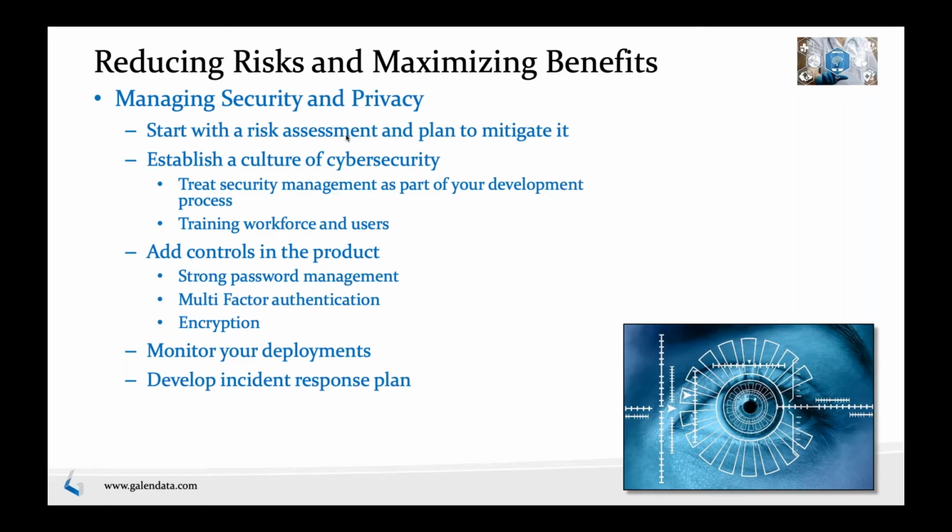Things like identifying who's responsible for what aspect of the response when something like this happens. You want to understand how you will identify which devices or systems are affected, and how you would isolate those systems as quickly as possible so that you can mitigate and contain some of those risks. You also want a cross-functional team as part of your response team, so that you are looking not just from engineering aspects, but also from your risk, quality, and management aspects as well. You figure out timelines that will require you to fix an underlying issue, or workarounds that can be done while you're fixing the underlying issues.